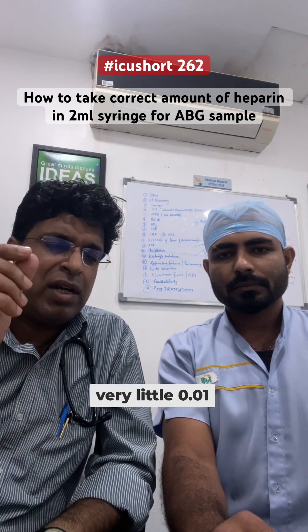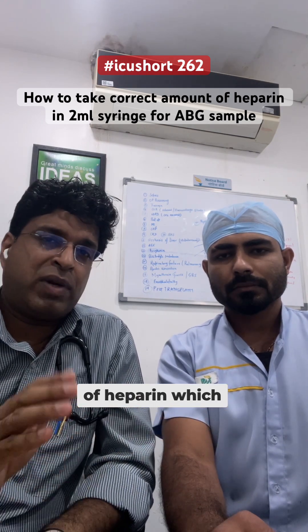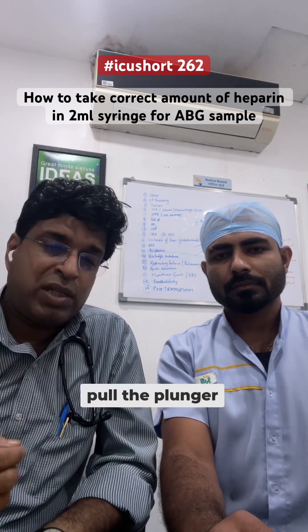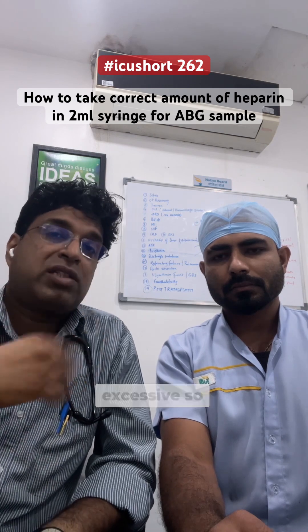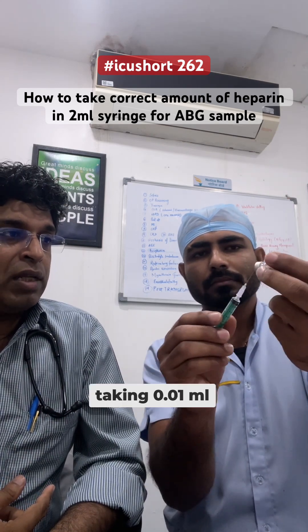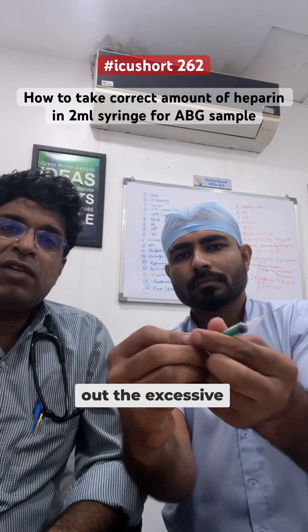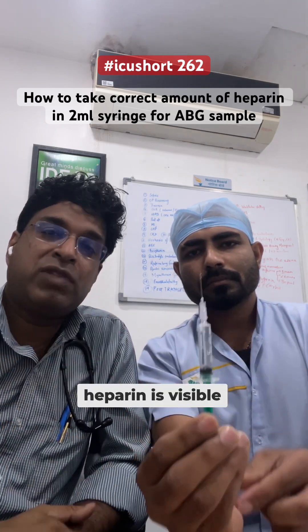Take only 0.01ml of heparin from the lowest concentration vial available, which is the 5000 unit vial. Pull the plunger to coat the inner tubing, then flush out the excess so that no droplet of heparin is visible inside the ABG syringe.